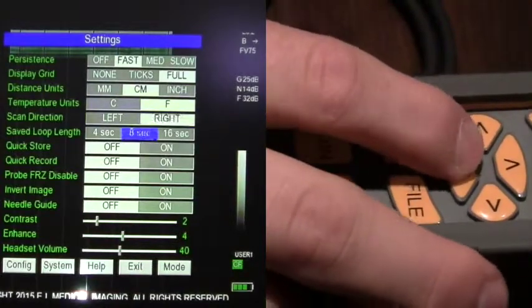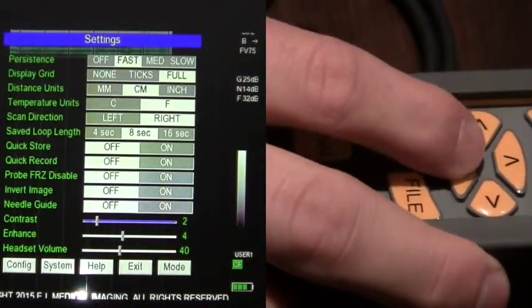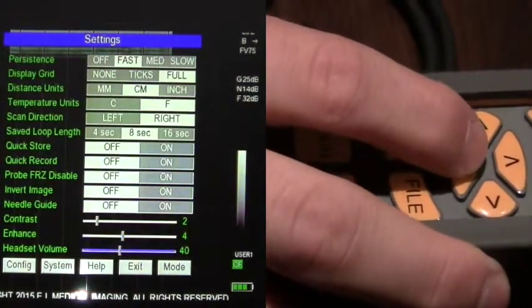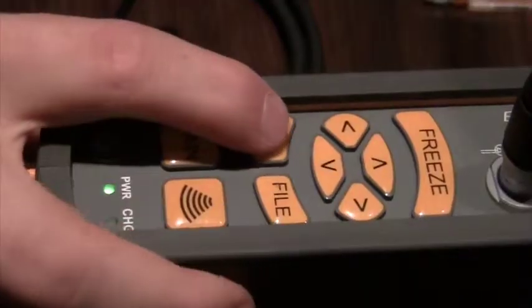When complete, scroll down to exit. When highlighted, hit Select.